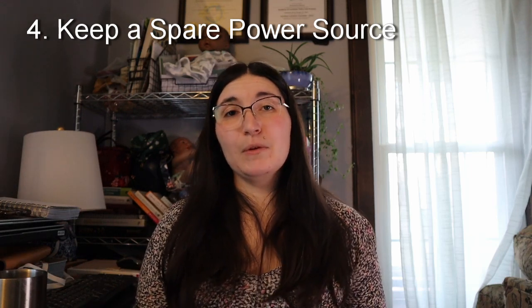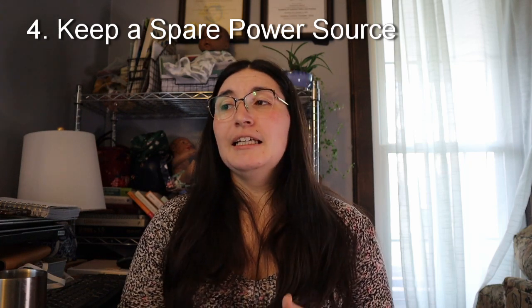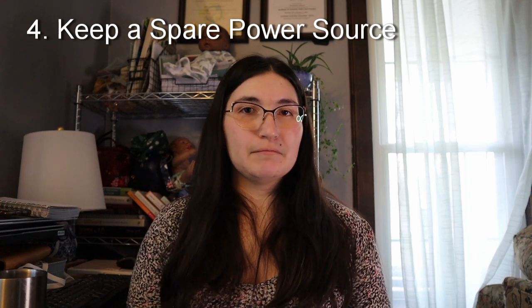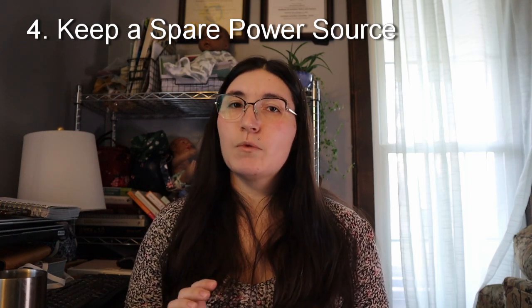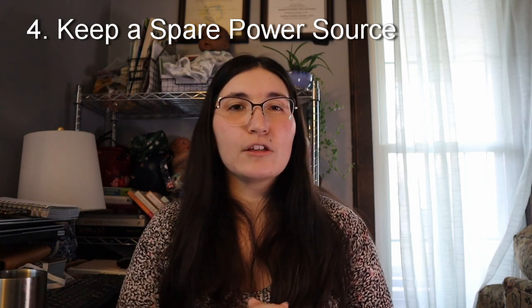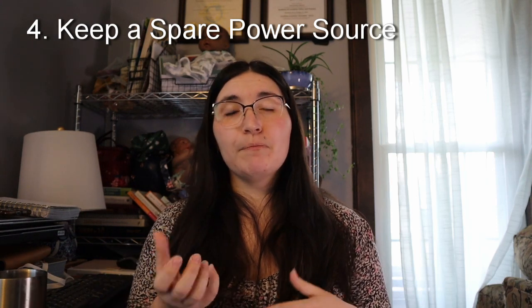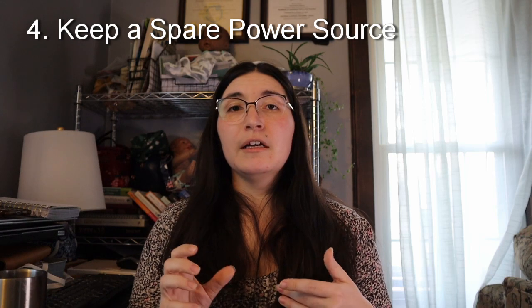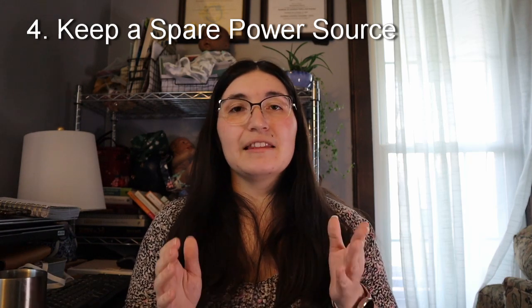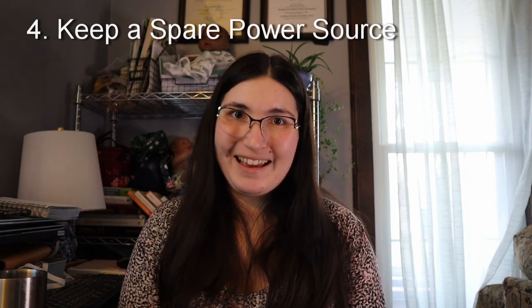Unless you're one of those people who responds much better to a manual pump or hand expression, it's going to be a wise choice to keep a spare power source, whether it's one of the power outlet like plug ins that goes in the wall for a traditional pump, or a battery pack charger for pumps that are battery powered. You know, you want one of those little power banks, anything like that that can save you in a pinch. Definitely keep one of those in your pump bag.